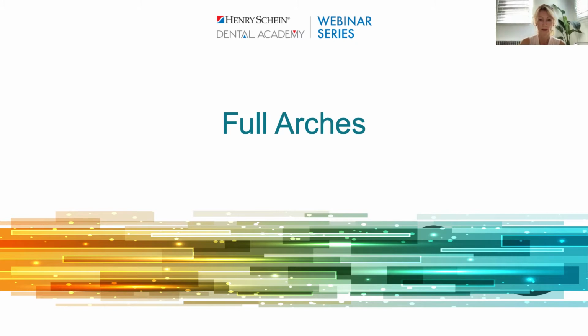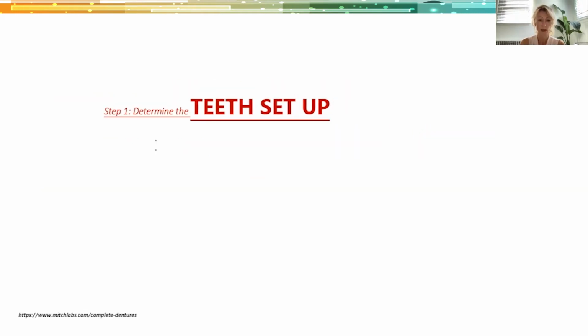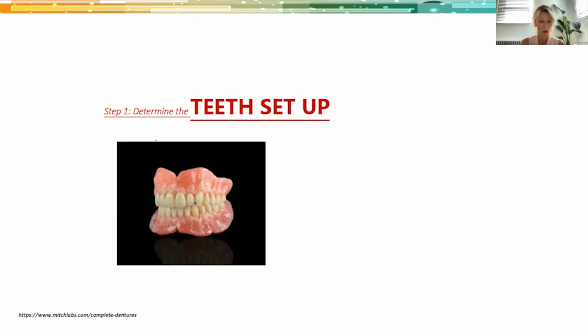The first one is determine our tooth setup. So what is going to be our future tooth position? So this is the complete denture concept. We need to imagine that we have no teeth and we're going to put the teeth in the best possible position. And what would that position be? So that is the first step.